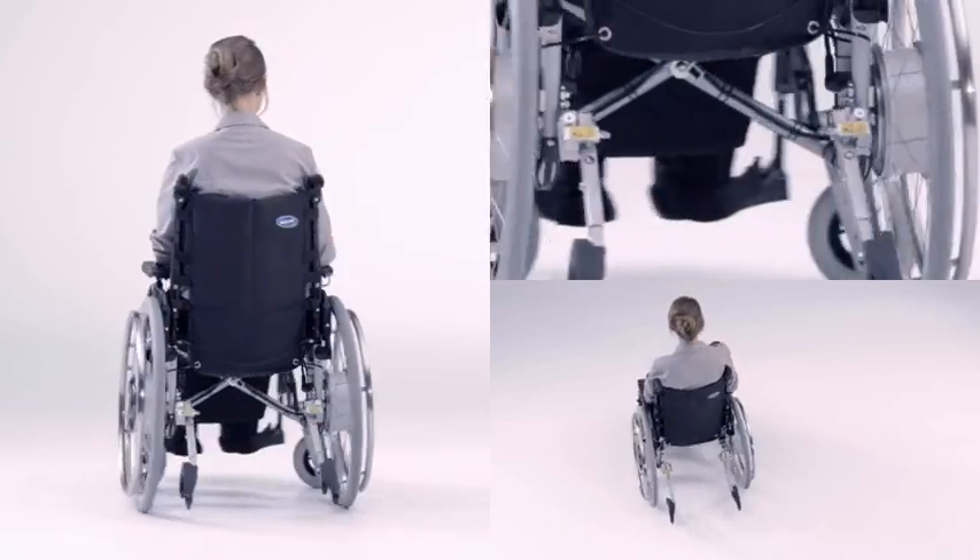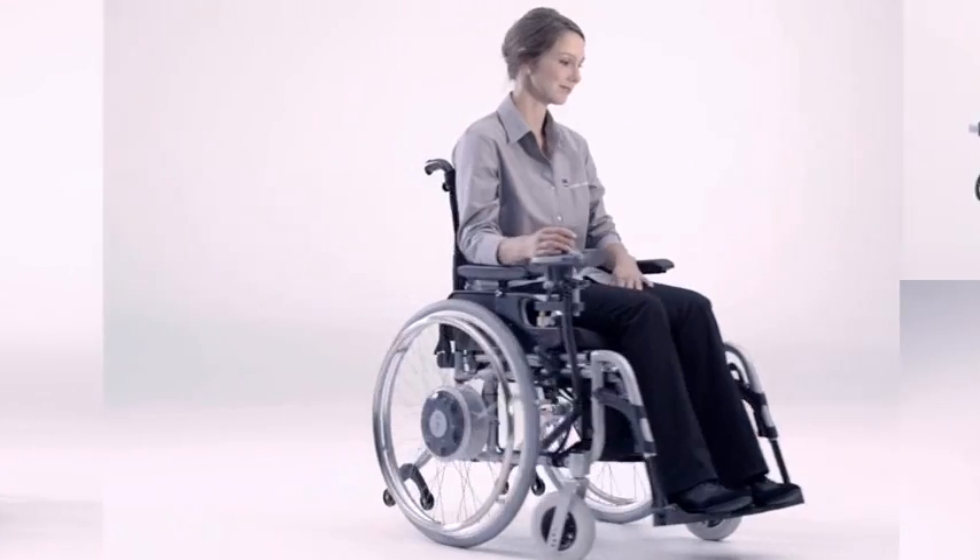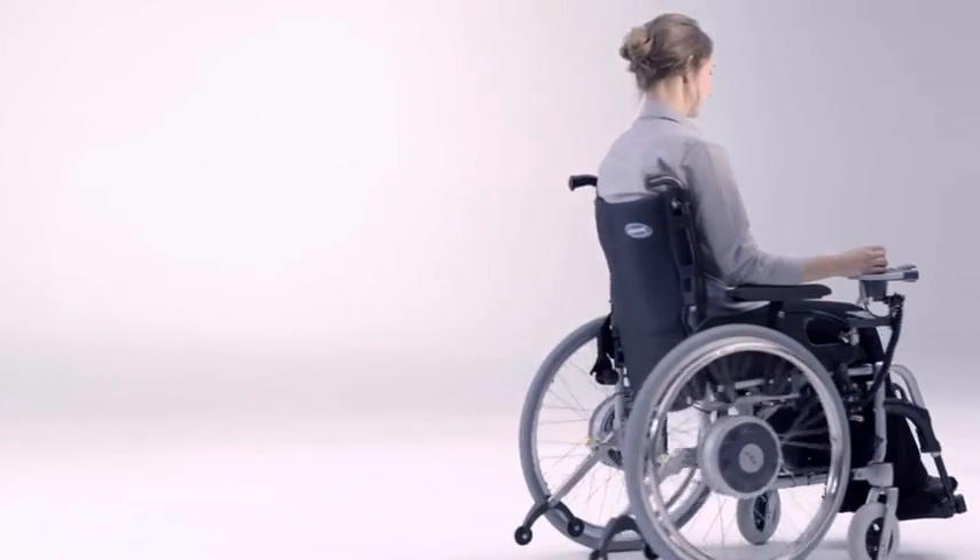Thanks to eFix, the wheelchair remains extremely manoeuvrable and will even turn on the spot. Controlling the drive is child's play.